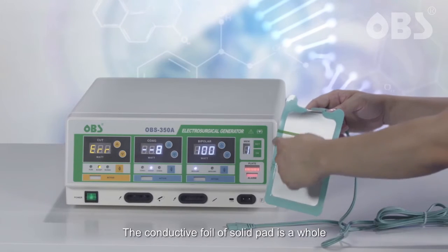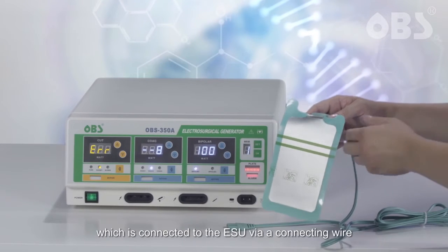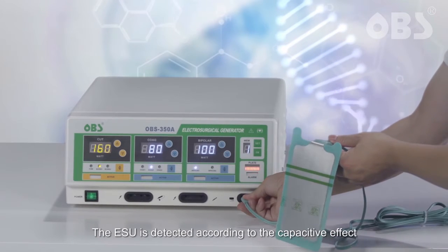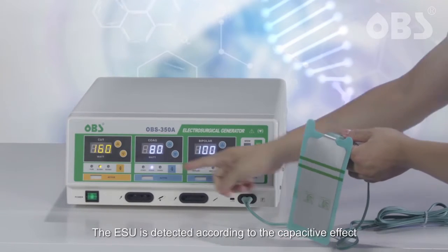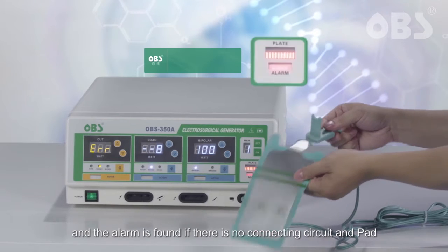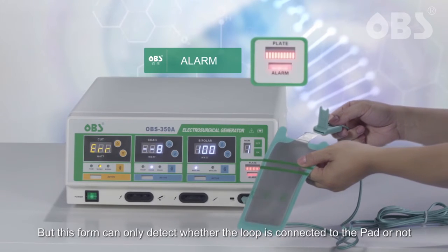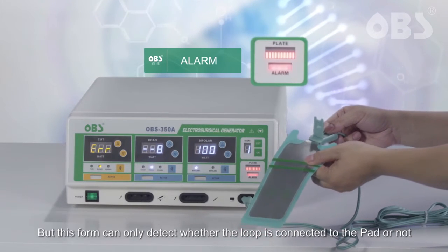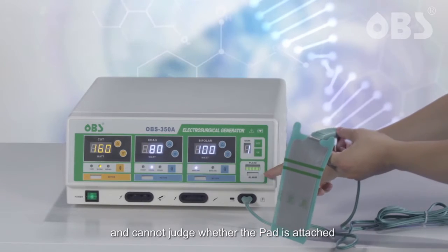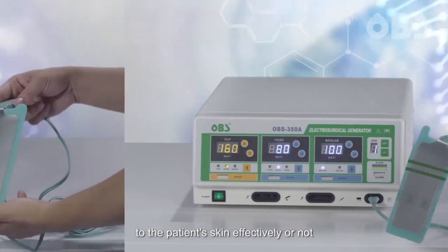The conductive foil of the solid pad is a single piece, which is connected to the ESU via a connecting wire. The ESU detects according to the capacitive effect, and an alarm sounds if there is no connecting circuit between the ESU and the pad. But this form can only detect whether the loop is connected to the pad or not, and cannot judge whether the pad is attached to the patient's skin effectively or not.